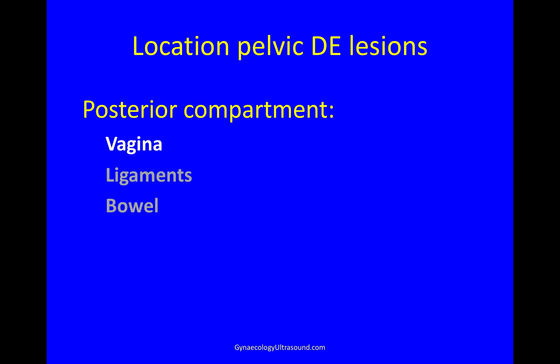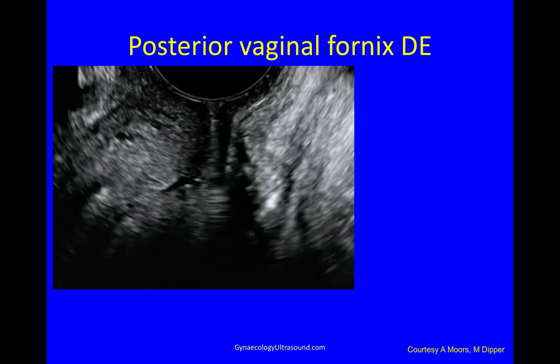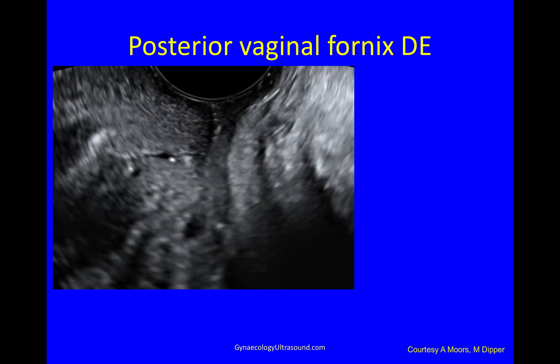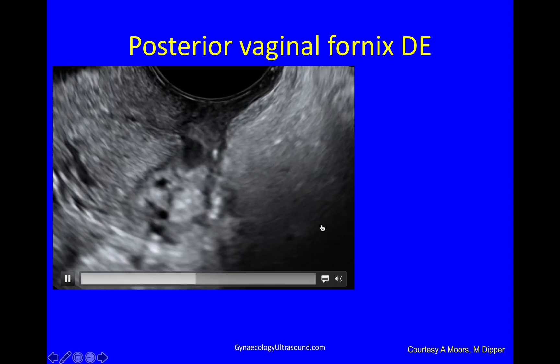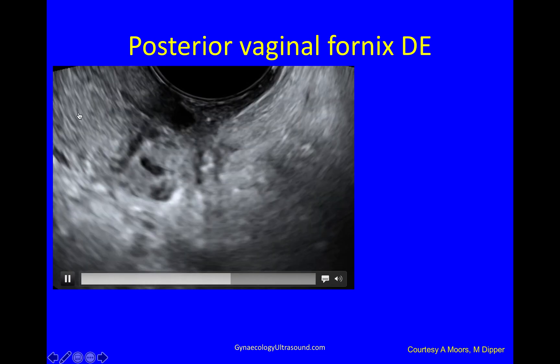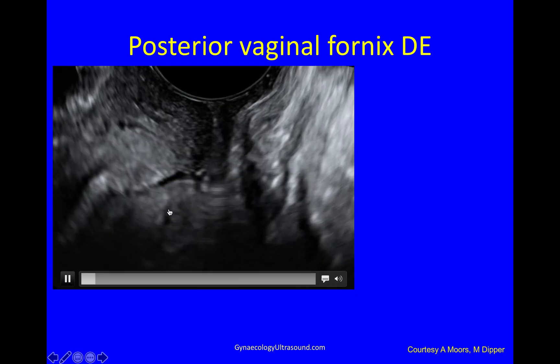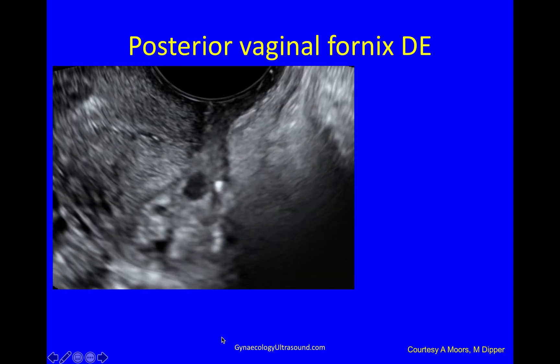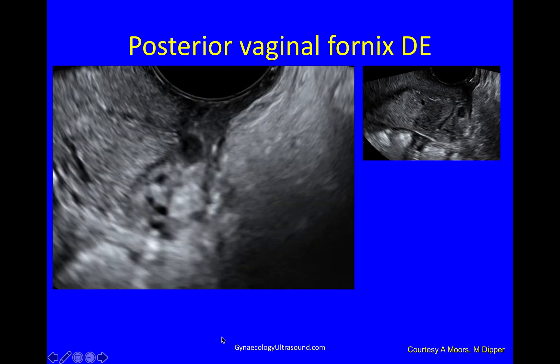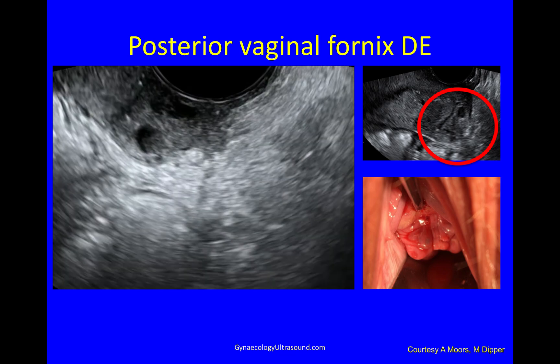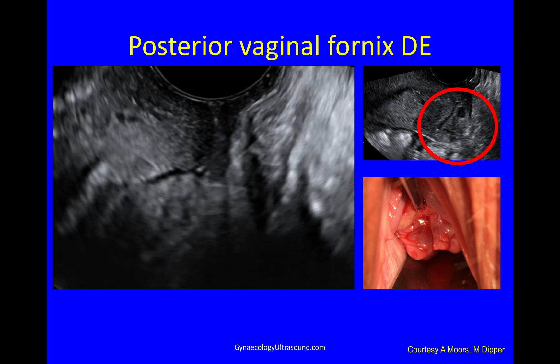Next, you look for nodules of deep endometriosis. I usually start in the posterior compartment, and I break it up into small sections. Here I'm putting the probe in gently, pushing the cervix away, and here is a nodule of deep endometriosis in the posterior vaginal fornix — and that looks like that on speculum examination.